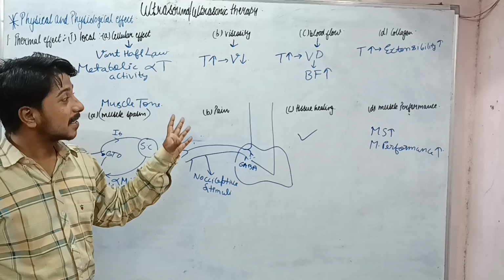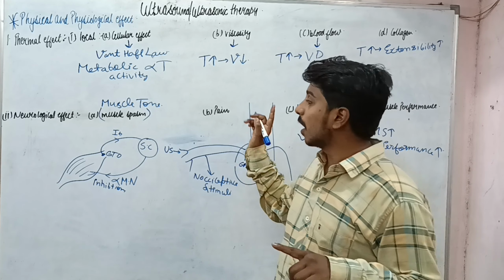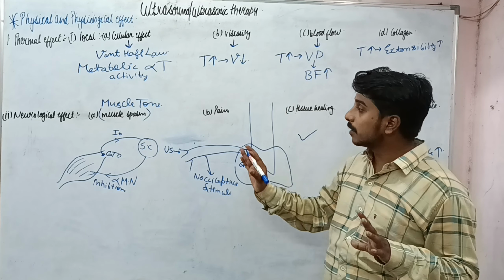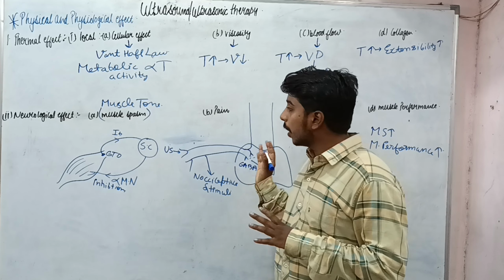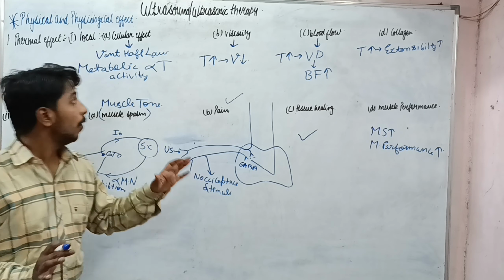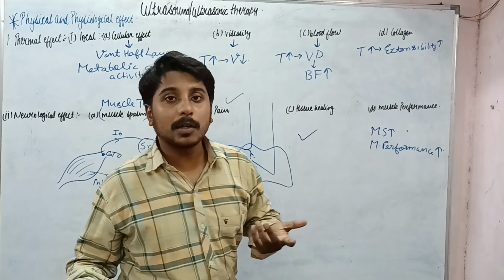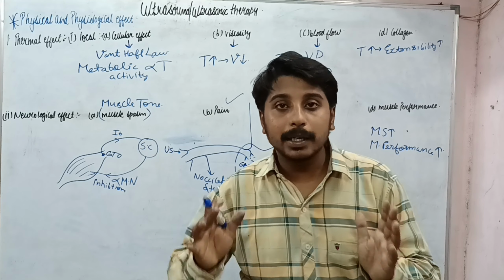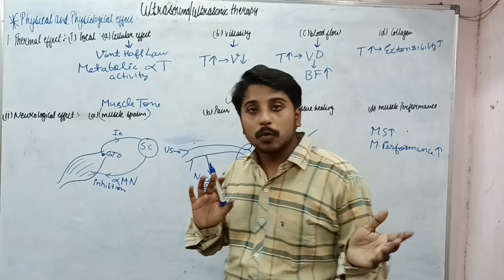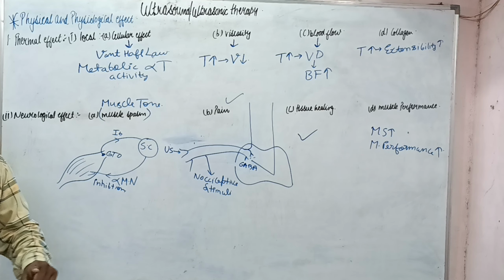So these are just similar to the physiological effects of heat. I have just explained these things briefly, because we have already discussed the pain gate theory. So till now we have completed the thermal effect. In the ultrasound topic these effects are written in a paragraph, okay, so there is one line, but I suggest you make points like this.